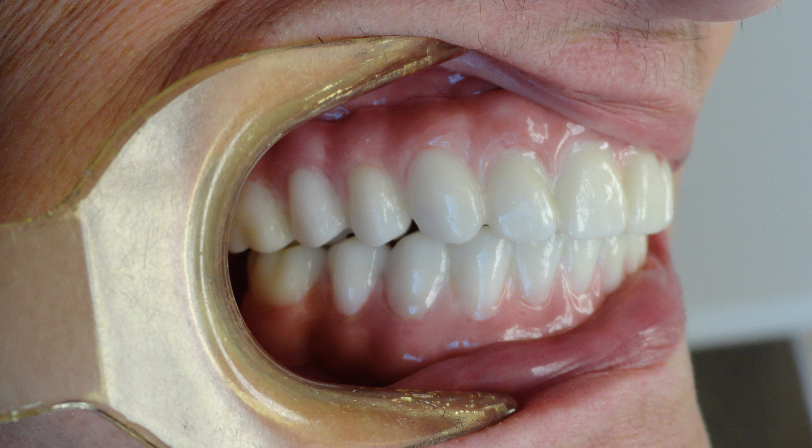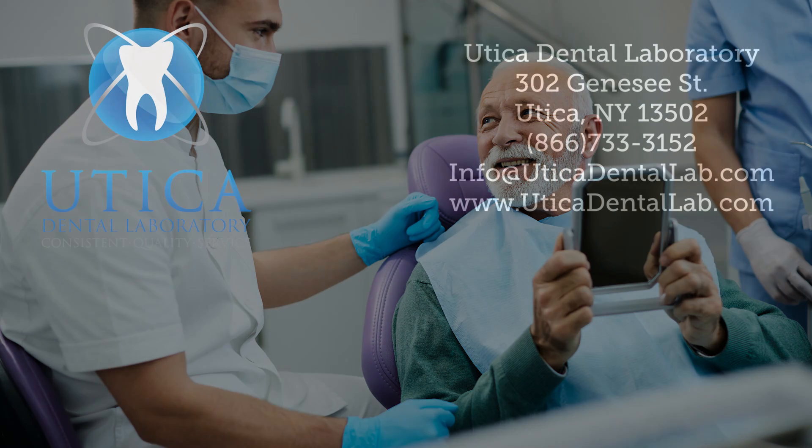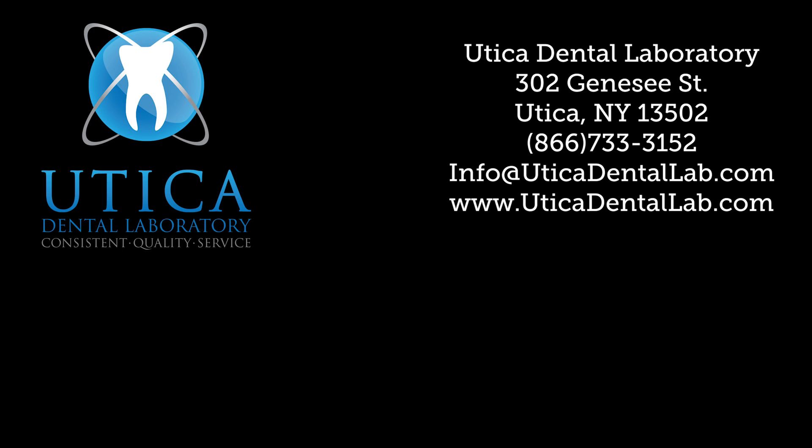The all-on-four full zirconia implant arch — the closest restoration you will find that replicates your natural teeth. Consistent quality service, this case and every case, at Utica Dental Laboratory.